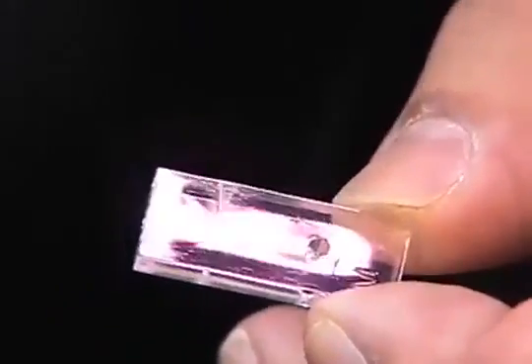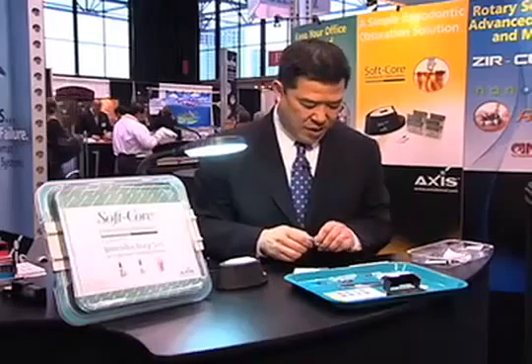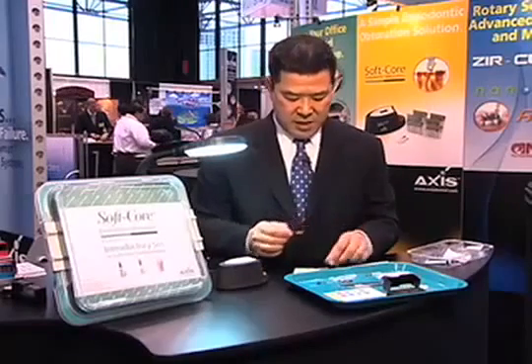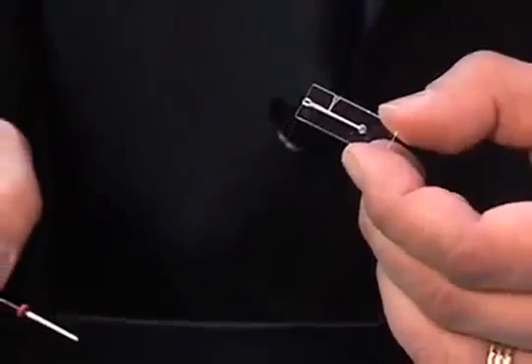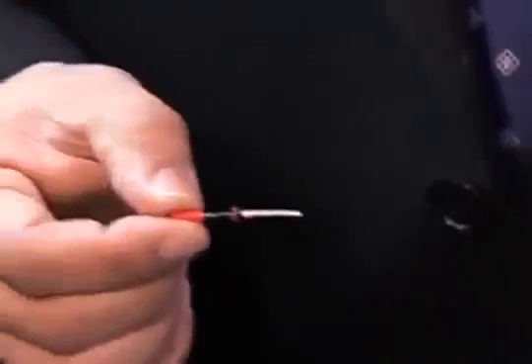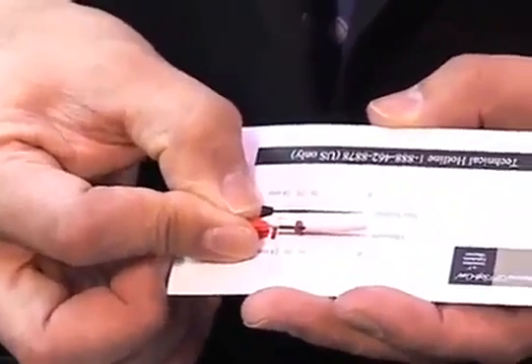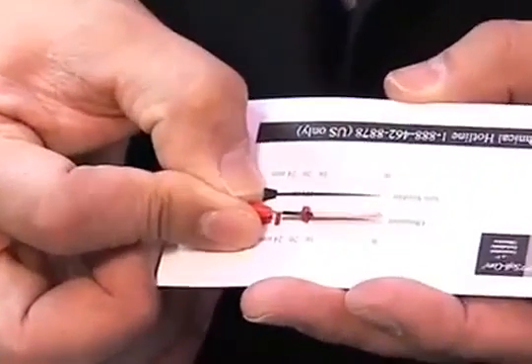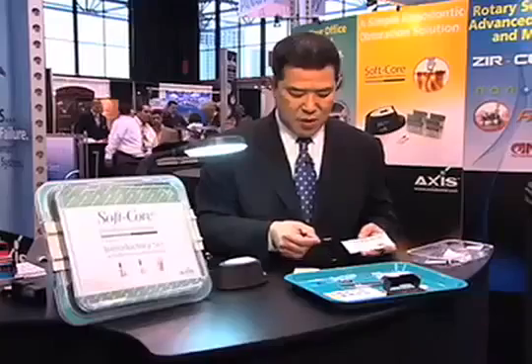Now, what I'm going to do next, I'm going to put this down and grab one of the obturators, and if we look at this plastic piece, it's at about 18 millimeters. So with the obturator and what's included, if you have a ruler you can use that, but with every kit there comes a little ruler and you can measure. I have set the rubber stop to 18 millimeters here so that we can fill it to 18 millimeters.